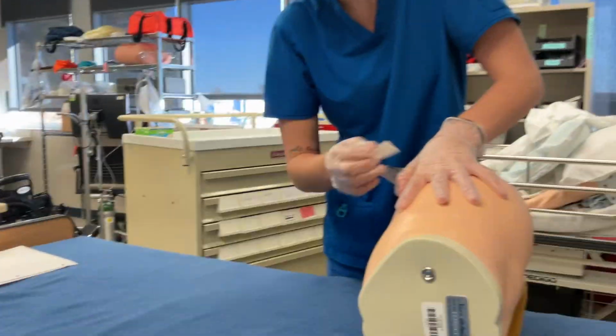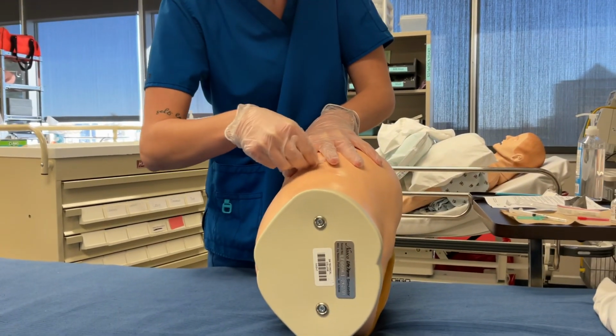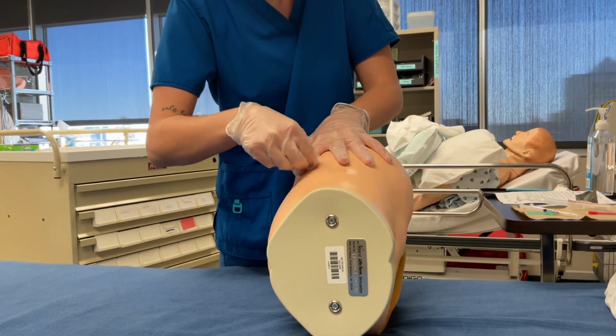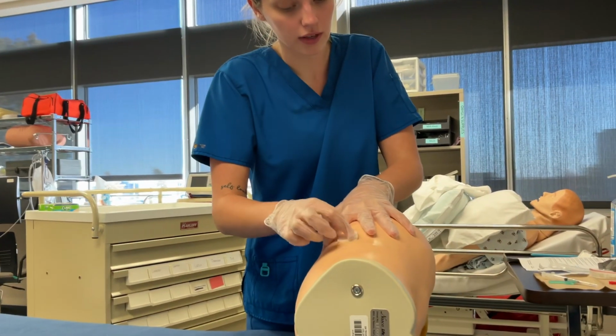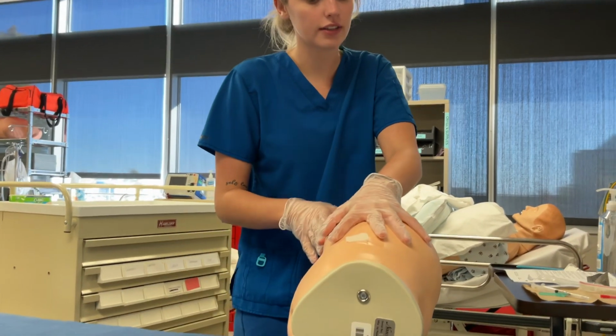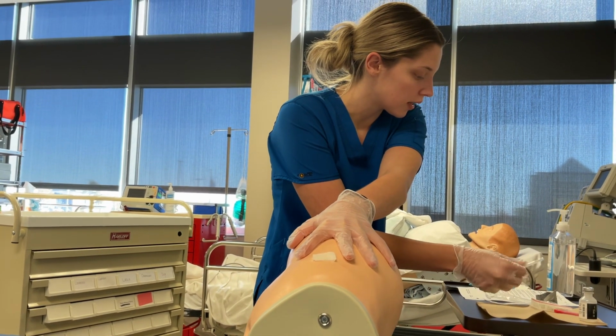and then I'm going to cleanse the site for 30 seconds in a circular motion. Keep that above where I clean, let it dry for 30 seconds. And then I'm just gonna pop this off.